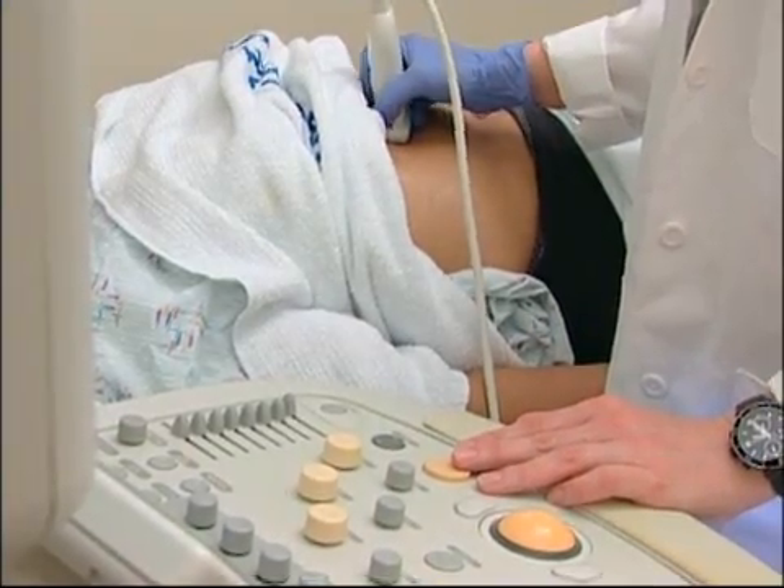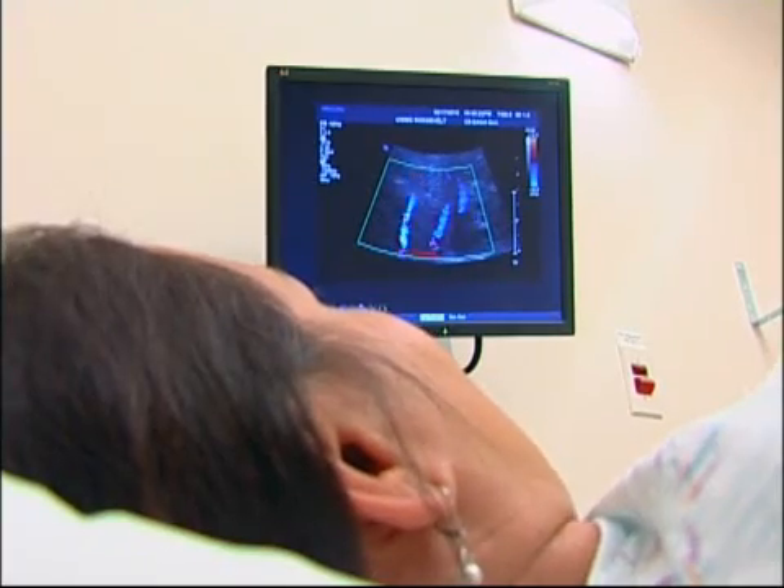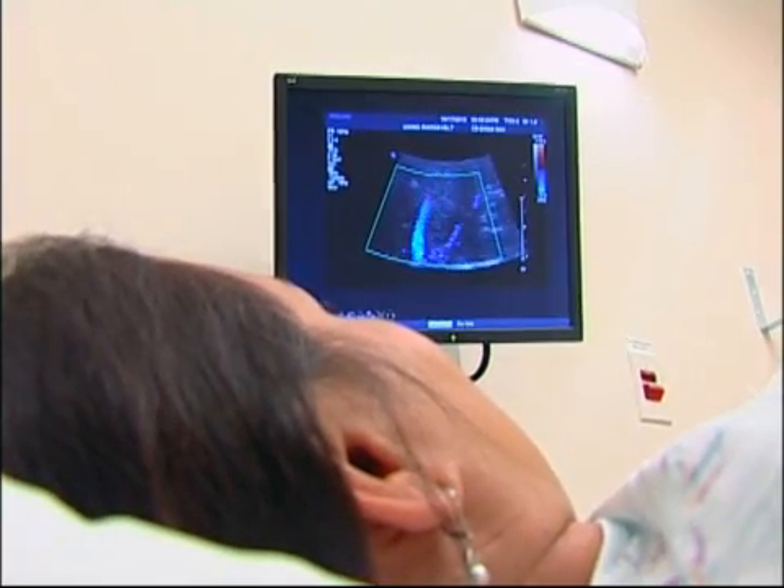There's usually no discomfort. The images produced through ultrasound examination often provide information that's valuable in diagnosing and treating a variety of diseases and conditions.